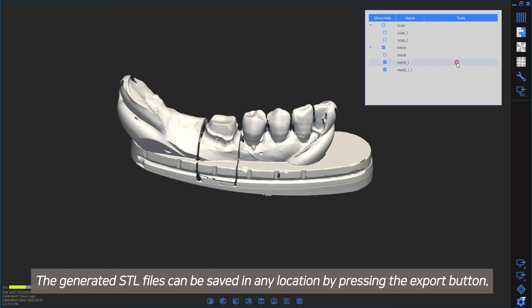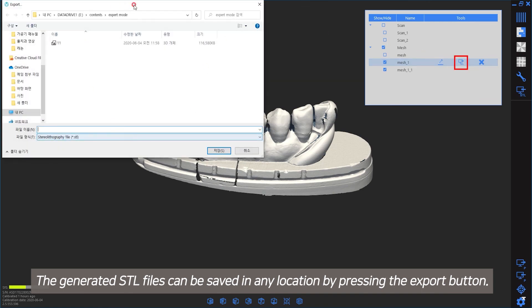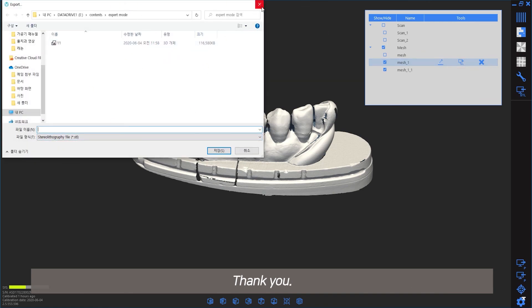The generated STL files can be saved in any location by pressing the Export button. Thank you.